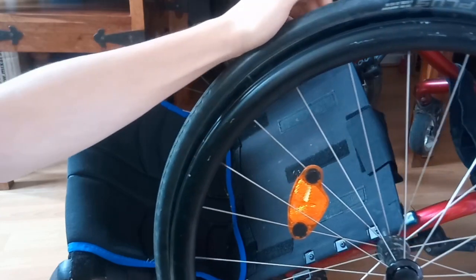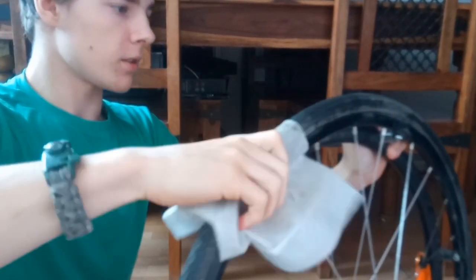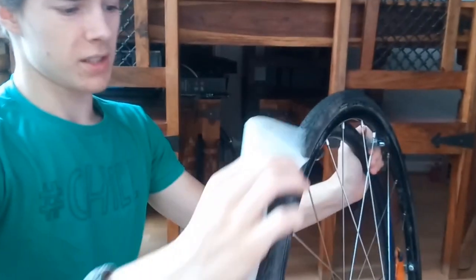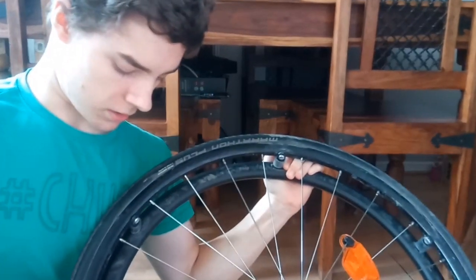Yeah, that's pretty much it for the wheels. Gone all the way around already. Very simple. And then I'm going to do same thing here. Just on both sides. I will just move that away. I don't need that at the moment. So all I'm really doing is just going along here with one of these. Obviously there's not much point in doing the main wheel. It's mainly this part that I'm cleaning, not really the tyre, because obviously it's the tyre, it's designed to get muddy, but obviously it doesn't hurt if you do.